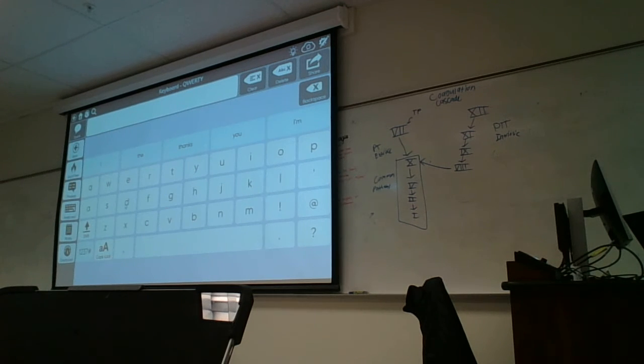When we go out and do a demonstration, or I do the demonstration, I usually ask the therapist to tell me a little bit about the client that we're going to see. Part of that is just to prepare a certain page set for the user. We certainly discuss their positioning, so I always ask, are they able to sit upright at a table so that we can just bring in the tabletop mount and set them up, or is there the need for me to bring in a rolling floor stand to be able to have them set up if they're in a recliner or their bed. So there are different types of options for mounting.